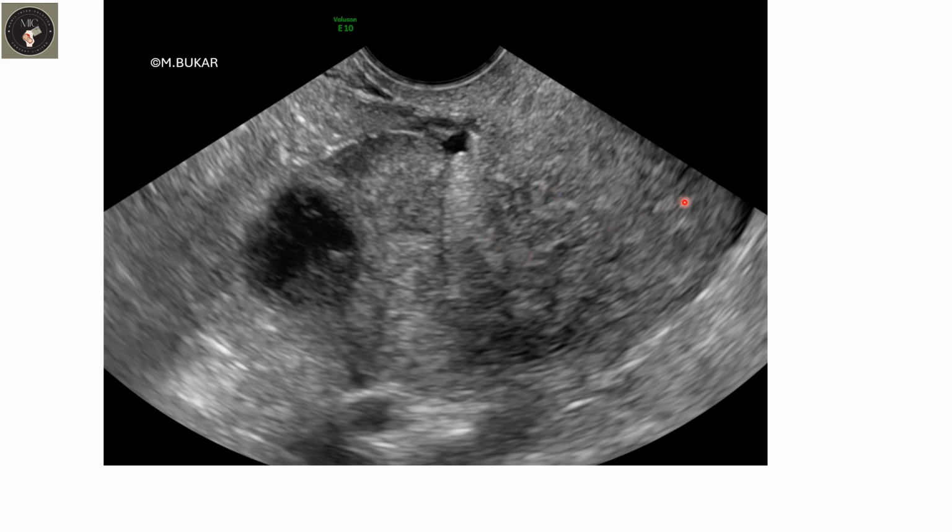At the beginning, I will slide the transvaginal probe towards the lesion and see whether the ovary will move away from the uterus or not. Secondly, I will use dynamic scanning by placing my left palm in the suprapubic region and apply pressure from above and also slide the transvaginal probe. This is what is called dynamic scanning.